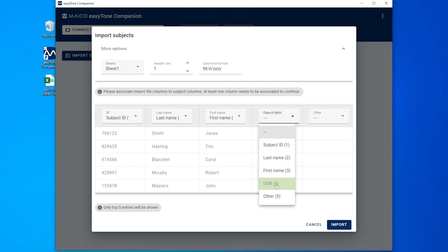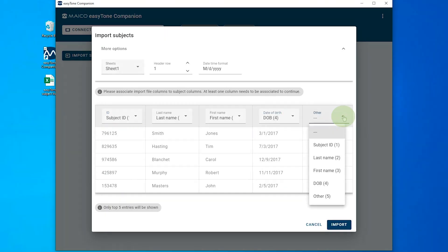Do this for each column title. If there is no content to populate a column or you wish not to import the content, leave the selection with dashes.